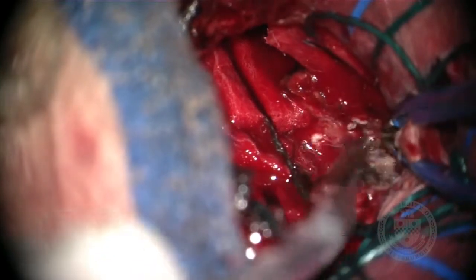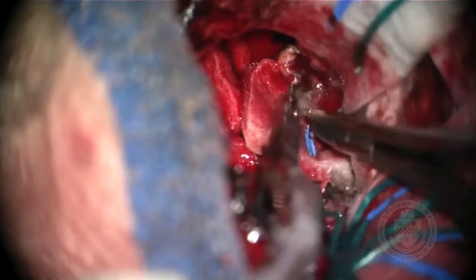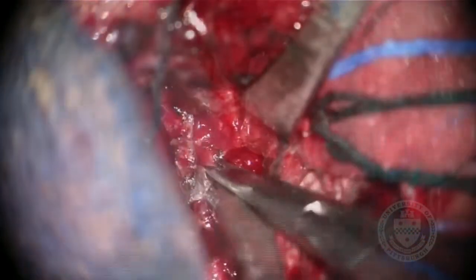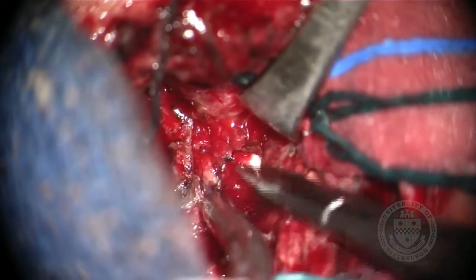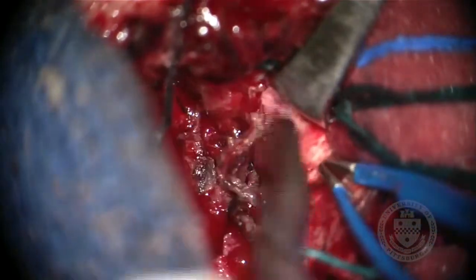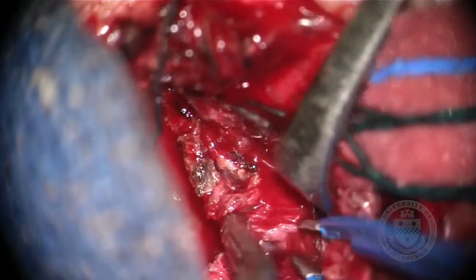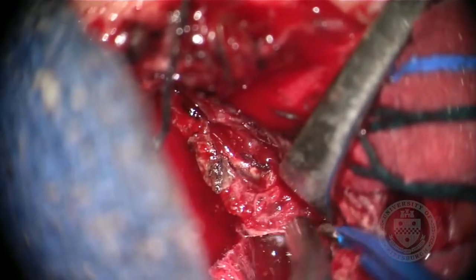We are now at the level of the dentate gyrus where the vascular supply to the hippocampus is entering, so we perform careful coagulation at this level, followed by transection of the coagulated tumor. We continue to peel away tumor from the brainstem area and from the cistern. That's the choroid plexus — we want to keep that attached to the brain. This is the posterior extension of the choroid plexus with tumor attached to it.